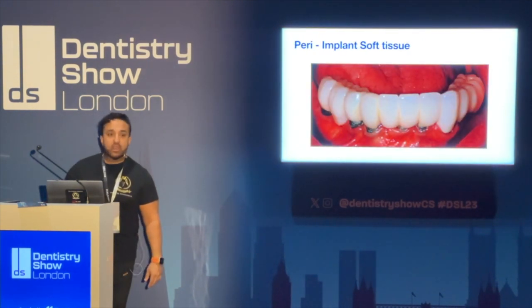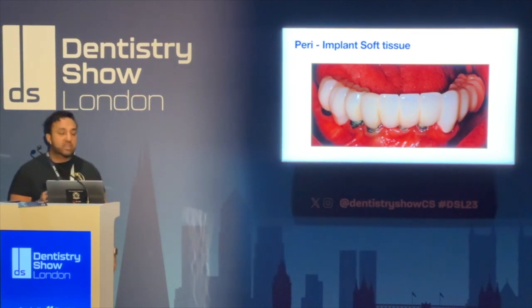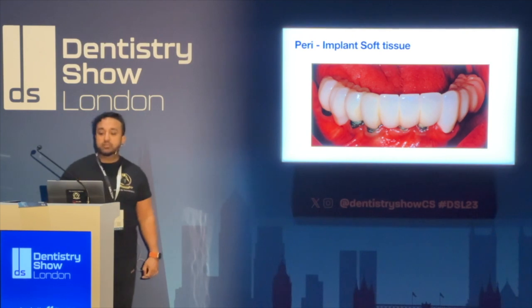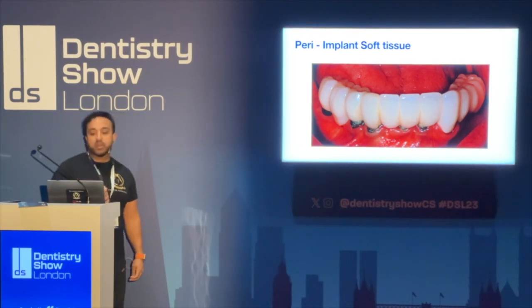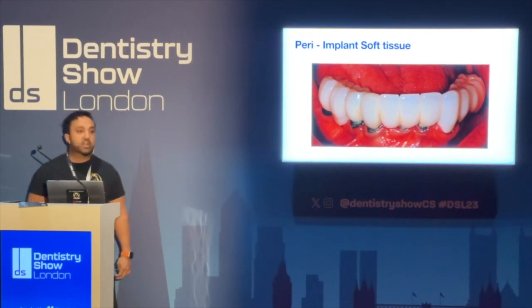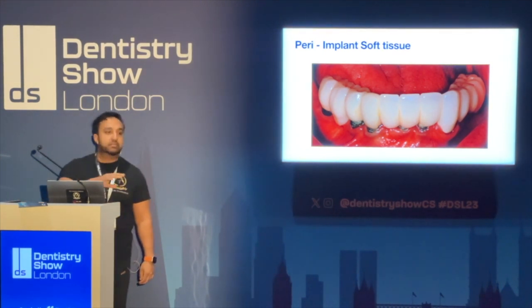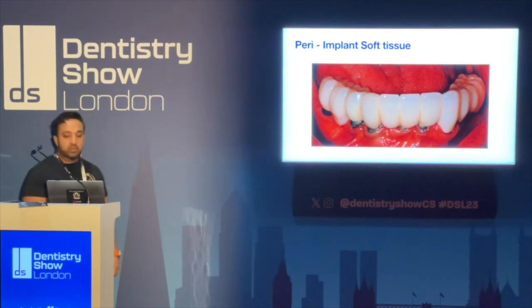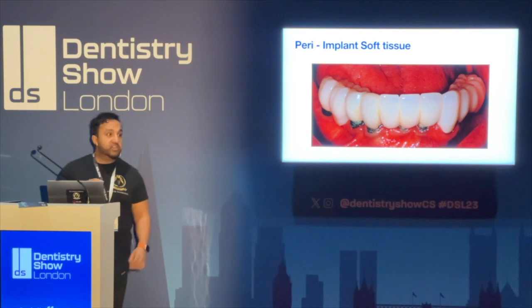The other thing that I really harp on about is understanding peri-implant soft tissue. Yeah? And peri-implant soft tissue, if the implants, for example, here we can see a full arch prosthesis, it's not ideal because this has been cement retained on a patient with very thin mucosa, very thin gums around there.